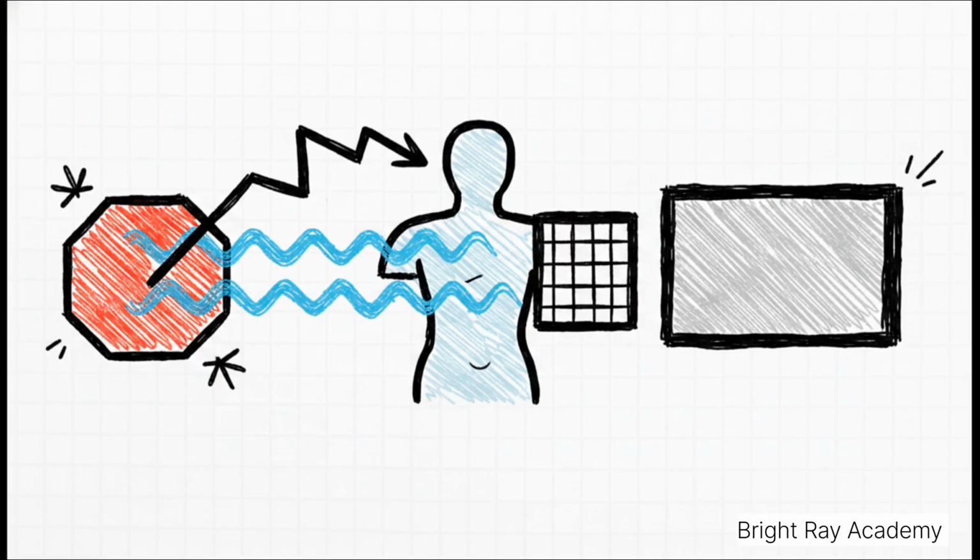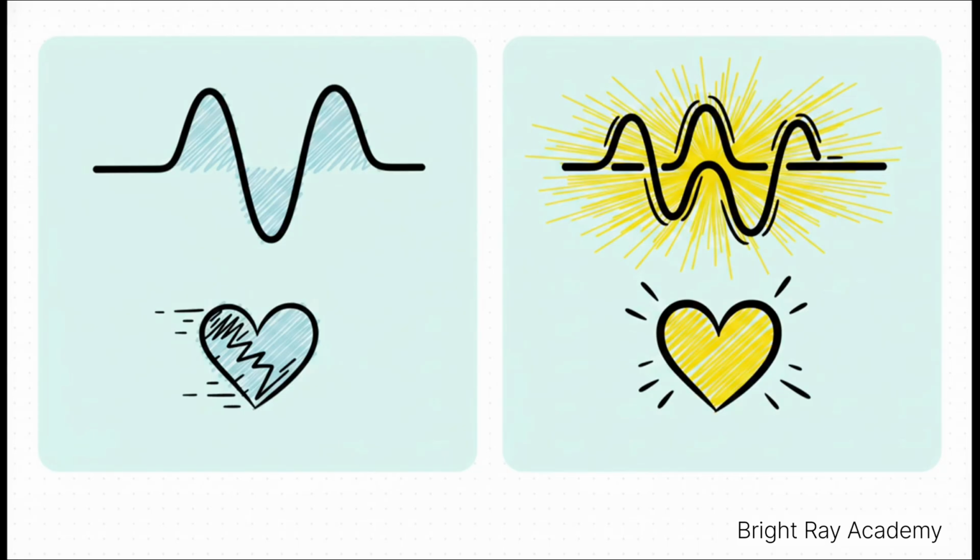It typically uses these flat radiolucent ionization chambers positioned between the patient and the receptor. Once that chamber detects that the exact right amount of radiation has been reached to create an optimal image density, it instantly sends a signal to break the circuit and terminate the exposure. It's basically automated precision.